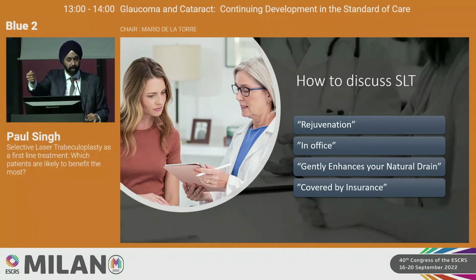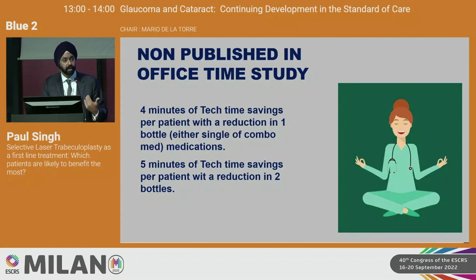Just like a laser pointer we use, the laser doesn't hurt you. It is actually something that just excites the tissue. So these are things that I use. I do think it is also important to recognize the impact of taking someone off of one drop.